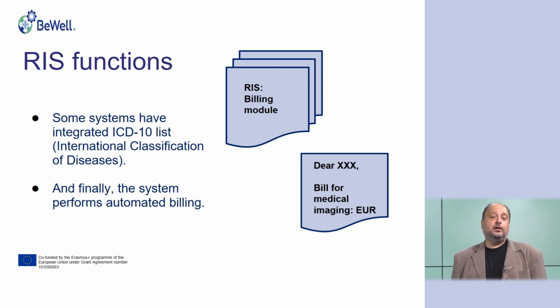Even the radiologist report can be sent by the radiology information systems, but be very careful with this option, to always be sure that the proper patient receives the report. So it can be better if the report is not sent automatically, but only when the patient requests it.